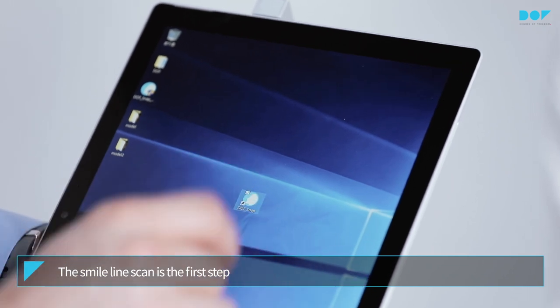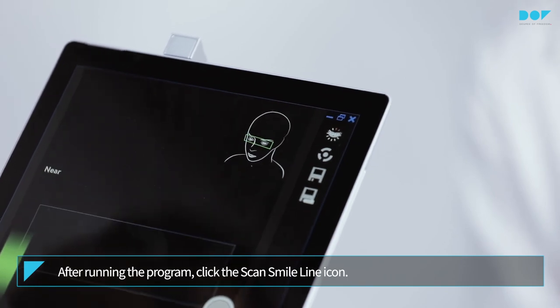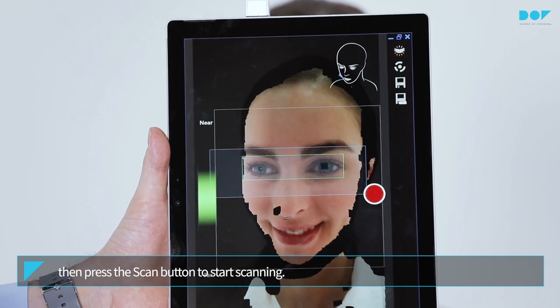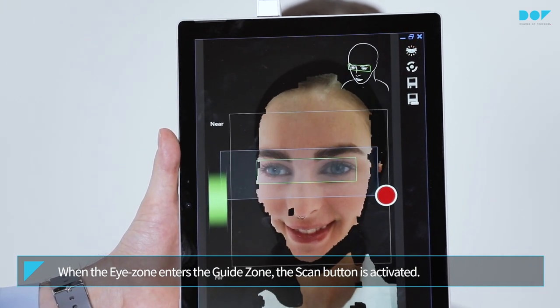The smile line scan is the first step. After running the program, click the Scan Smile Line icon. Position the scanner so that the front of the face is on screen. Then press the Scan button to start scanning. When the eye zone enters the guide zone, the Scan button is activated.